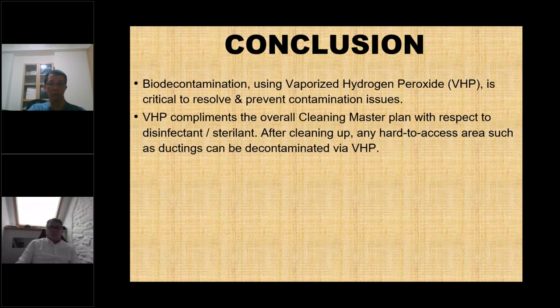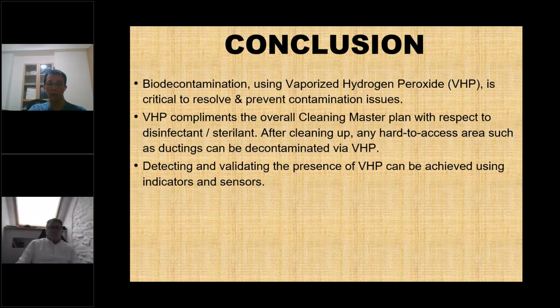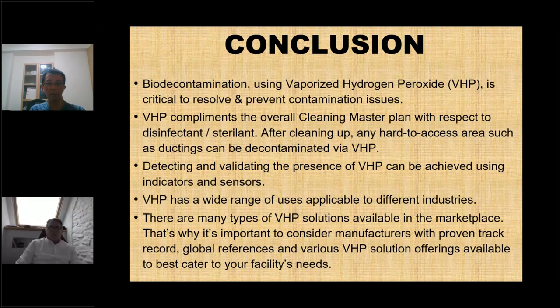Biodecontamination using VHP is critical to resolve and prevent contamination issues. We talked about how you can detect and validate VHP using the different indicators and sensors. We have different industries and users, from defense all the way to pharmaceutical and medical devices. And lastly, there are many different VHP solutions out there in the market. That's why it's important to choose the correct manufacturer and vendor with a proven track record and references that can meet your needs.